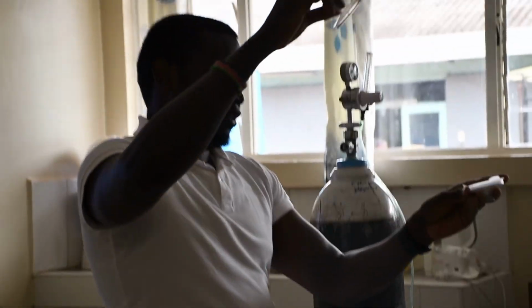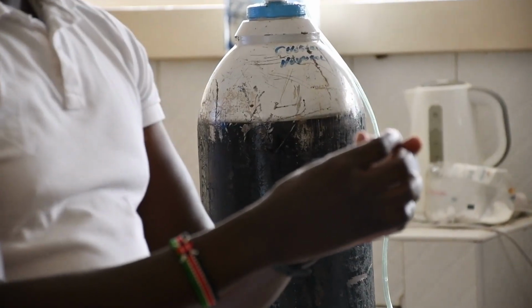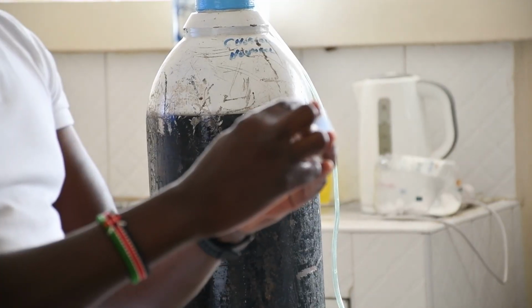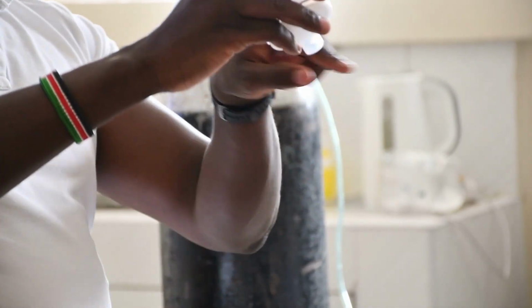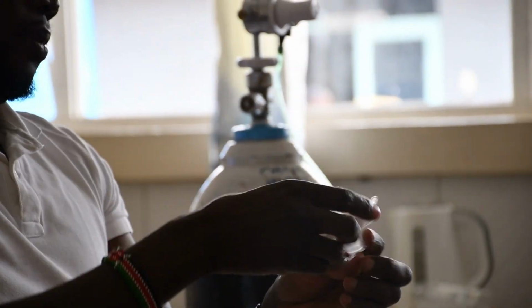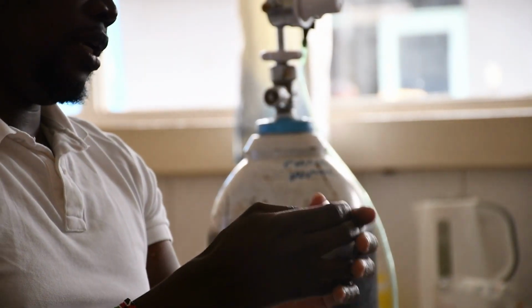Then you hold this, that comes on top, then gently, press it gently, don't push it all at once. Just gently first, so that the ring goes without any kinking, so it goes straight up. Then we want you to press these 3 points. Make sure that you press them hard, okay?